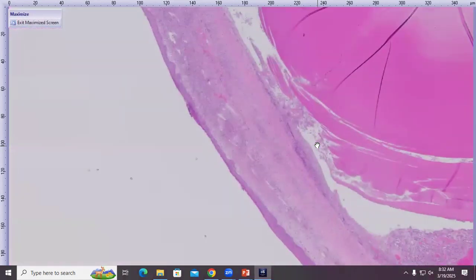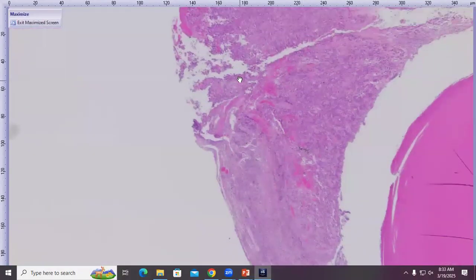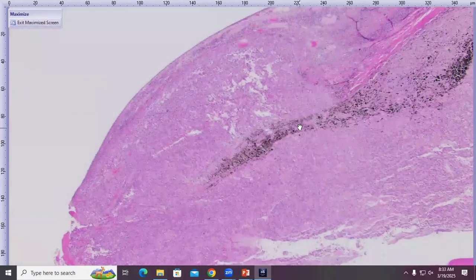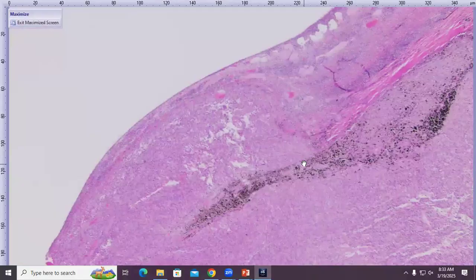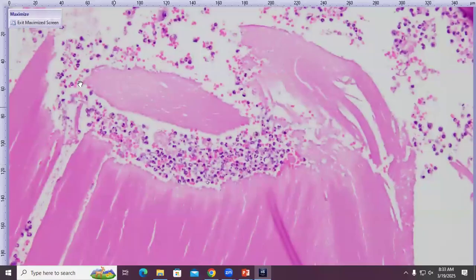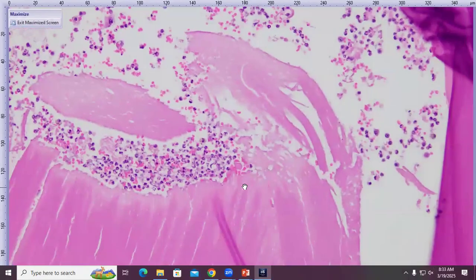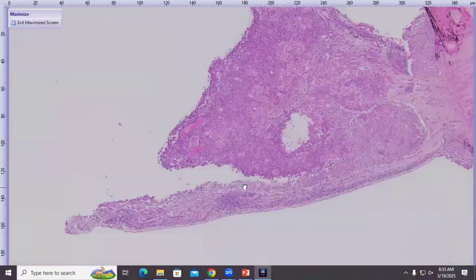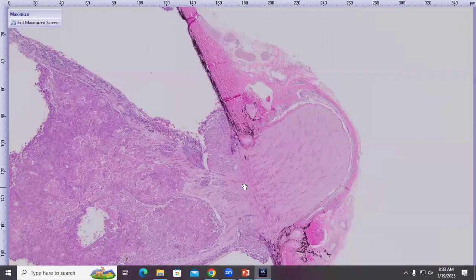Again, as we head over here, here's our cornea. The epithelium is pretty hyperplastic, with some keratinization and lots of inflammation, because again, we lose our collagen here at the limbus, and we can see the neoplastic masses leaving the globe here, and maybe a little bit of the uveal tract as well. Additionally, the lens capsule is also ruptured. And we can see inflammatory cells coming in and starting to nibble at these exposed lens fibers here that are also degenerate and cataractous. So we've got a uveitis and lens capsule rupture with this mass. Here in the globe, retina is detached, as I said, but again, optic nerve looks pretty clean, so that's good.